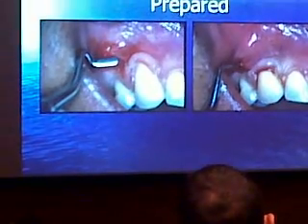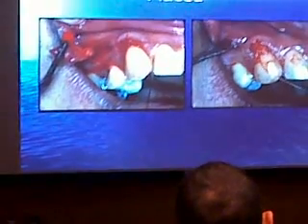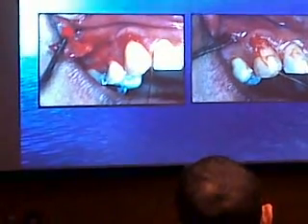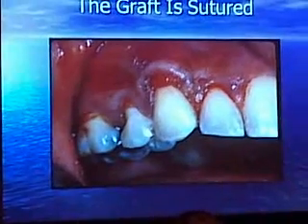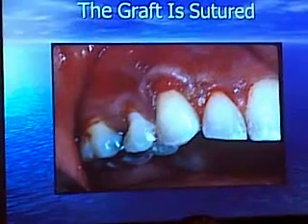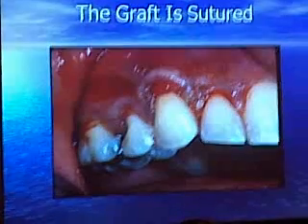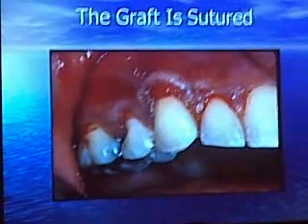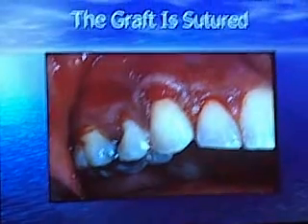Just move it frontally. Now, the graft is taken, put the suture through it, and then pull it inside, underneath the tissue. So here's the graft, part of the graft is showing. That gentleman there asked a question: this connective tissue is not supported by anything, but it's going to survive, and it's going to epithelialize from the epithelium from around the area.